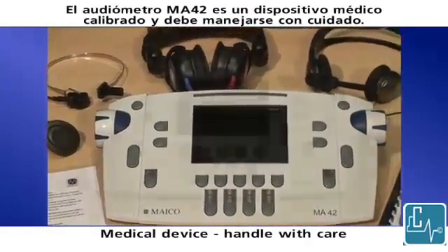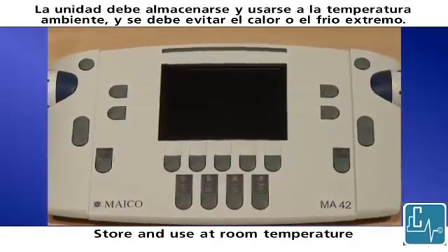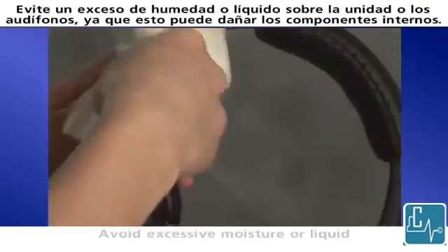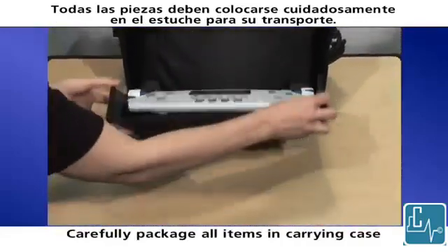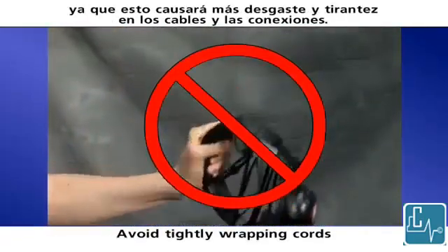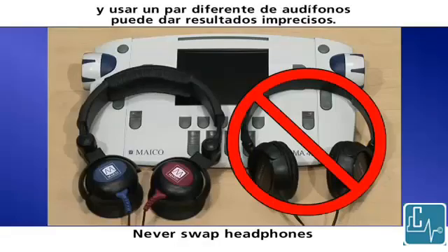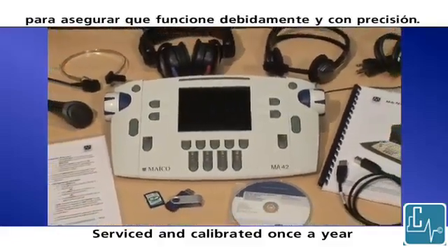The MA42 audiometer is a calibrated medical device and should be handled with care. The unit should be stored and used at room temperature and extreme heat or cold should be avoided. The audiometer may be cleaned with a damp cloth or disinfectant wipe. Please follow your facility's policy and recommendations for cleaning and disinfection. Avoid excessive moisture or liquid on the unit or headphones as this may damage the internal components. All pieces should be carefully placed in the carrying case for transport. Avoid tightly wrapping the cords as this will cause additional wear and tear and strain on cords and connections. Never swap headphones or any transducer without having the unit recalibrated. Each transducer is specifically calibrated to the unit and using a different transducer may give inaccurate results. It is recommended that the audiometer be serviced and calibrated once a year to ensure proper function and accuracy.